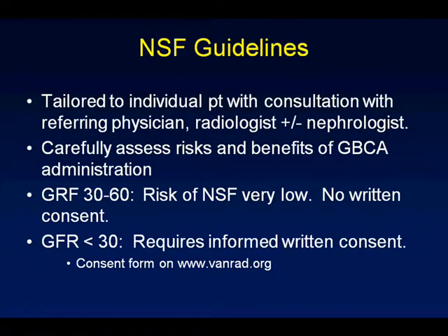So basic guidelines: if a patient has impaired GFR of less than 30, you have to weigh the risks and benefits of giving gad and discuss this with the referring physician. A nephrologist may be involved, usually involved if the renal impairment is that severe. For patients with grade 3 impairment, GFR of 30 to 60, the risk of NSF is extremely low. We don't require written consent. We don't discuss the risk of that with the patient. We basically just order the gad if we deem it's necessary.